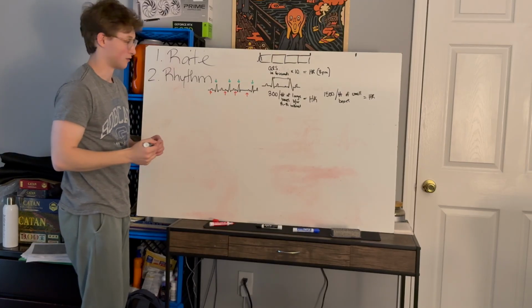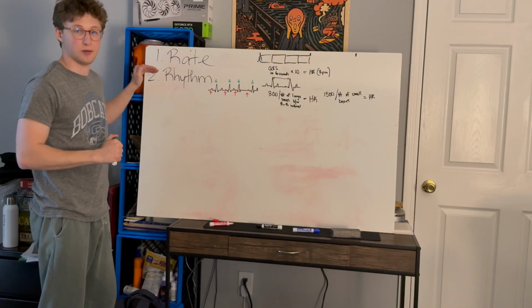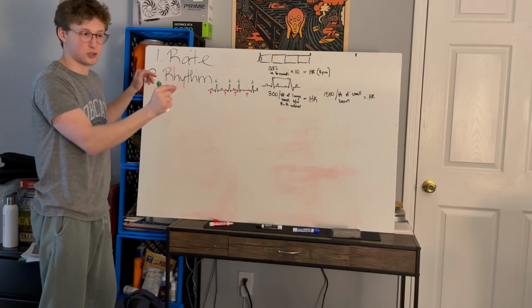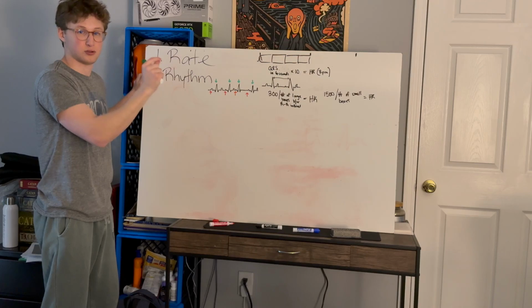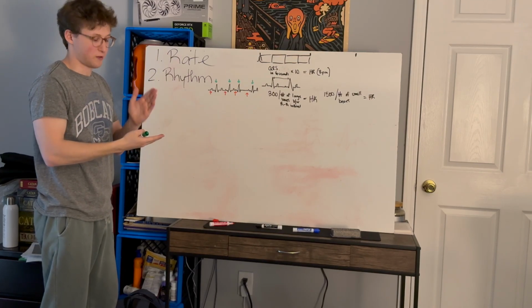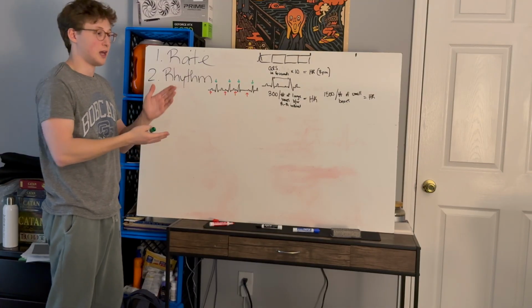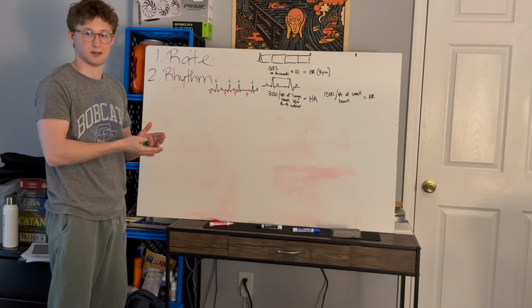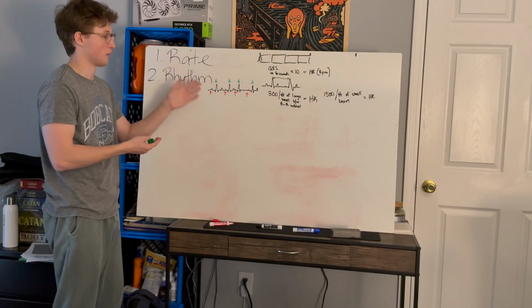It should be consistent. So first we have rate. What's our heart rate? Second, what's our rhythm? Do we have a consistent amount of time between each atrial contraction, each P wave? Do we have a consistent amount of time between each ventricular contraction, each QRS? You can have P waves and QRS complexes on your ECG, and the P waves can be consistent, but the QRS complexes are not consistent rhythm, or vice versa. Or you don't have P waves, you only have QRS complexes.